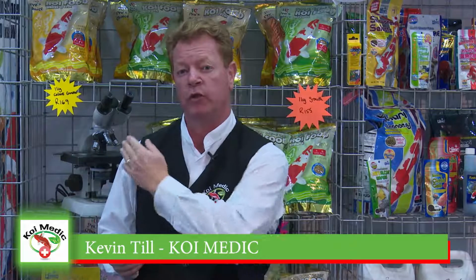What we're doing today is a microscope analysis, a scrape of the fish, in order to assess what is wrong with the fish. Like a cat or dog, when it starts scratching, we know it's got fleas or something that's worrying it. A fish can't tell us that, so we need to do alternative measures to assess what is wrong. Through the microscope analysis, we can pick up what parasites there are.